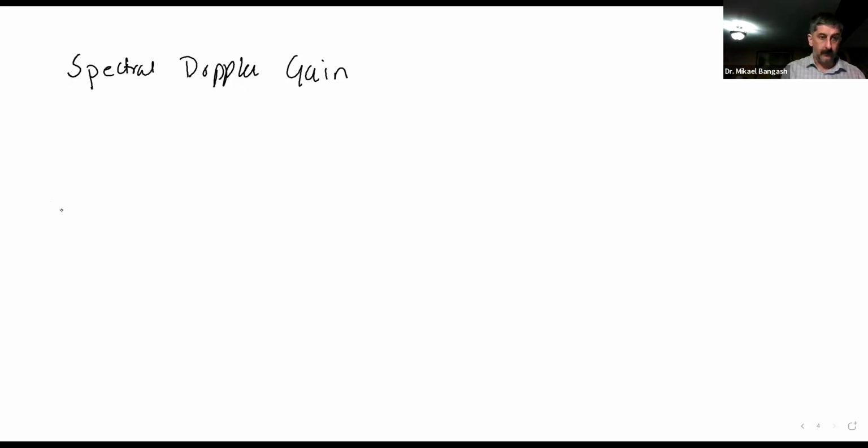And what does gain mean here? Well, we can just say it's the same: amplification. Amplification of what? Of the signals that produce the Doppler.